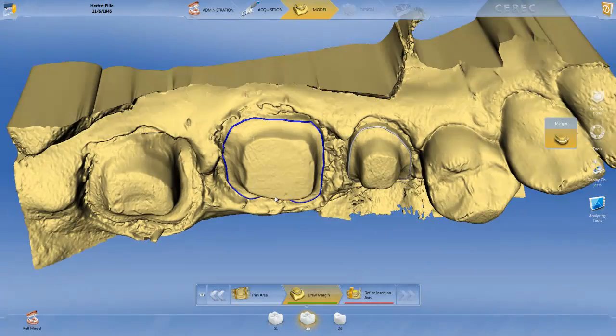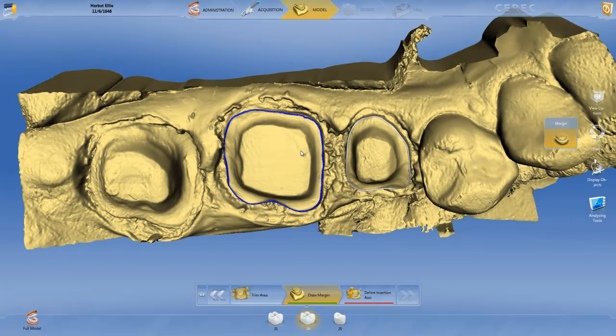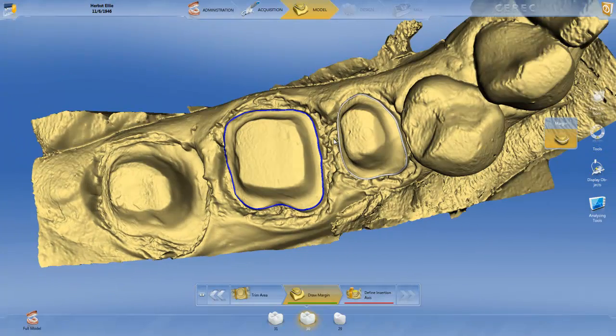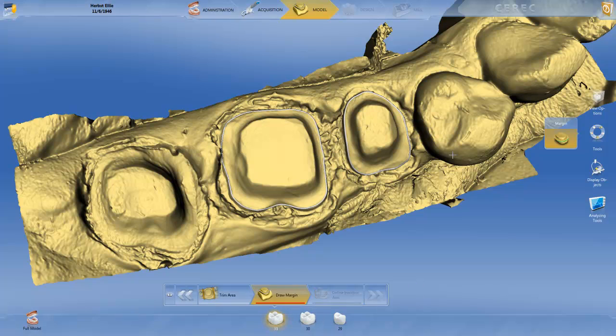So I'm gonna make sure I'm alright everywhere. Again, I'm working from my desktop, and everything you see, it's live. So that's number 30. Let's go with number 31.